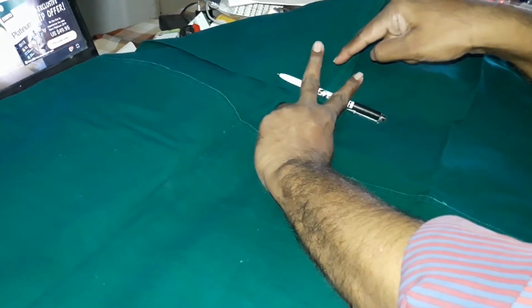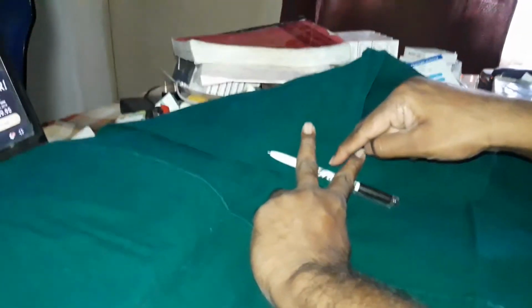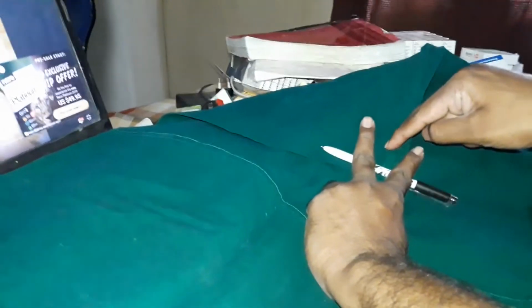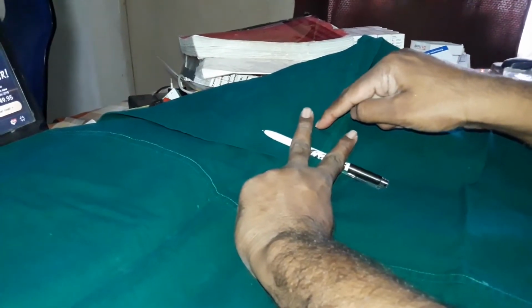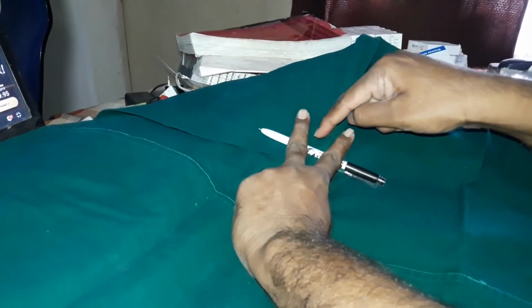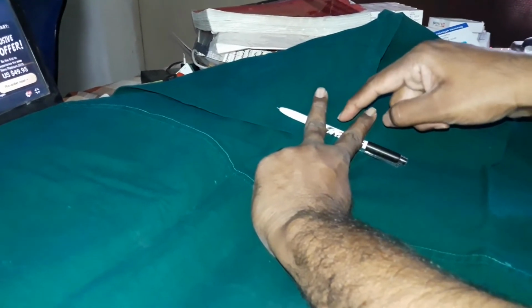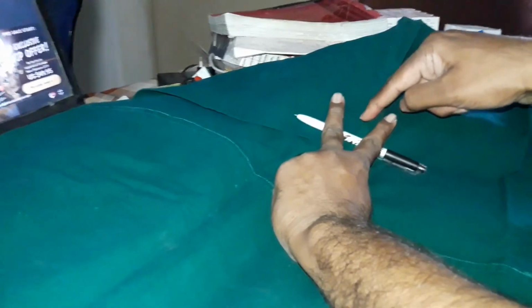Again I am giving a statement: however sclerotic the bone may be, always one sentinel cell, one small cell, is present in the upper space. All you need to do is just dilate that cell. Once you dilate that cell, you will see the incudostapedial joint.